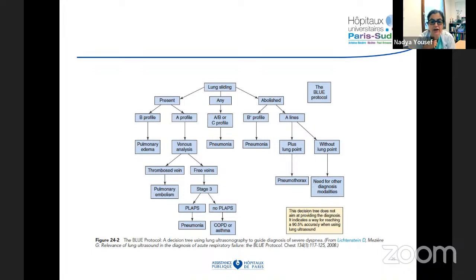We had one such patient presented in the beginning, trying to see how we can titrate this, because when we have signs of pulmonary overflow and poor thriving, then we're kind of in a vicious circle, or maybe we're moving on, like trying to evaluate, for example, persistent duct. Difficult to say. I mean, the question here is not should I treat or not, because we have 27,000 opinions on that. But the question is, do we have pulmonary complications related to this overflow? We can follow that up and see the progression towards a B-lines or B profile, or on the other hand, see whether we should take this into account when we decide how we manage the patients.